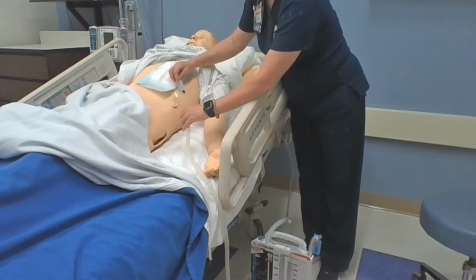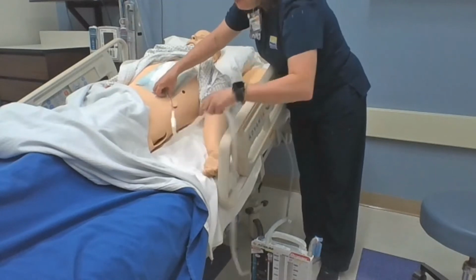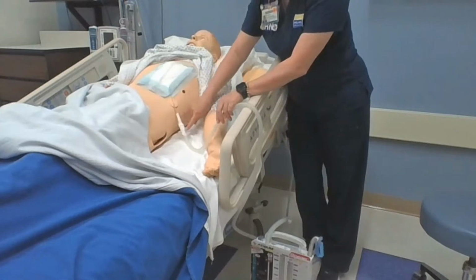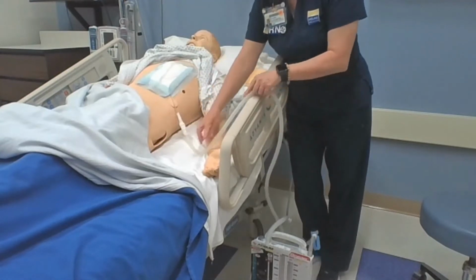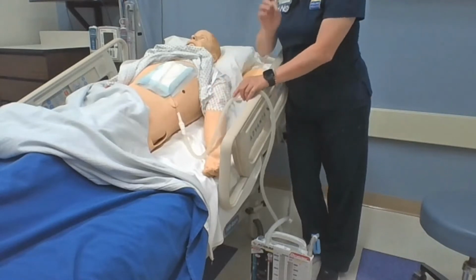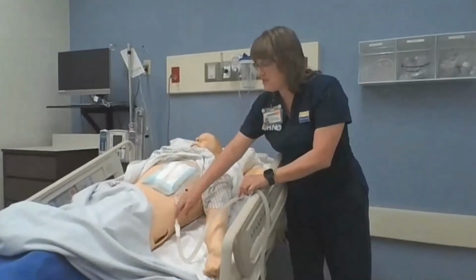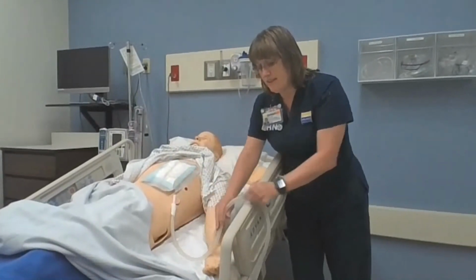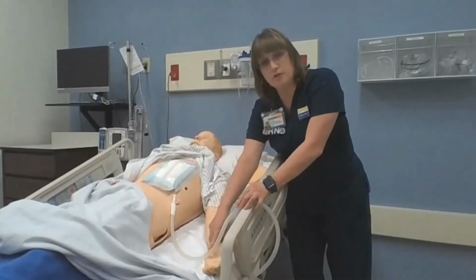So what do I need to do? Undo one side. Okay. So on my chest tube, I've done my site here. I'm now going to trace my tube. And what I'm tracing it for is I need to make sure I don't have what we call dependent loops. Now, dependent loops are anytime you have something going to gravity that then has to go uphill to then go downhill. So you can have them with Foleys.